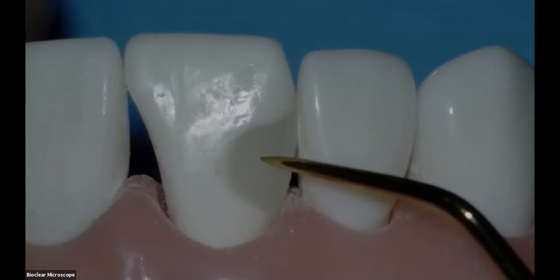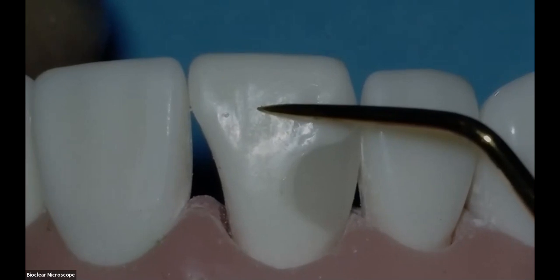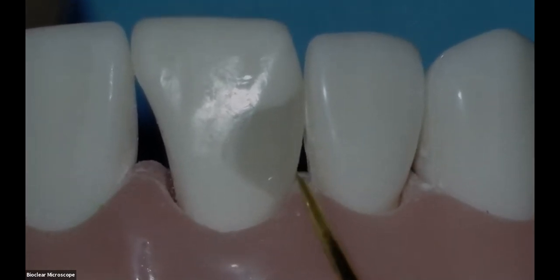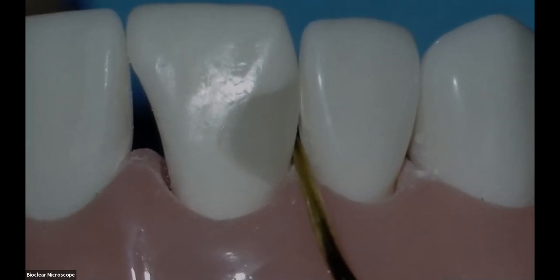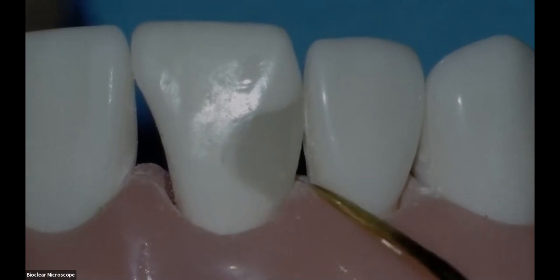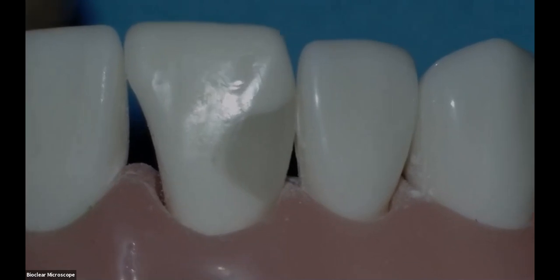Now, if that omnichromatic material was sitting on the facial, that would be okay because it's just translucent. But over here, like I said, it's not the look that we want. So we use Filtech Supreme Ultra because we like the opacity of Filtech Supreme Ultra to rejuvenate the tooth. So that is something that has 3 things that are wrong. They used the wrong composite, no radius bevel, and no additive.